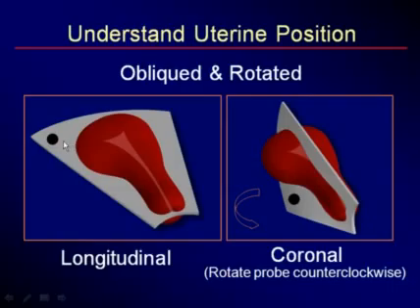That's its longitudinal axis, but to get its coronal axis, we have to keep rotating the probe counterclockwise 90 degrees, which ends up way down there in order to get our coronal view of the uterus. It would be very hard to understand this if you didn't think of how your beam is positioned, how the cervix helps you and leads you into the center portion of the uterus.